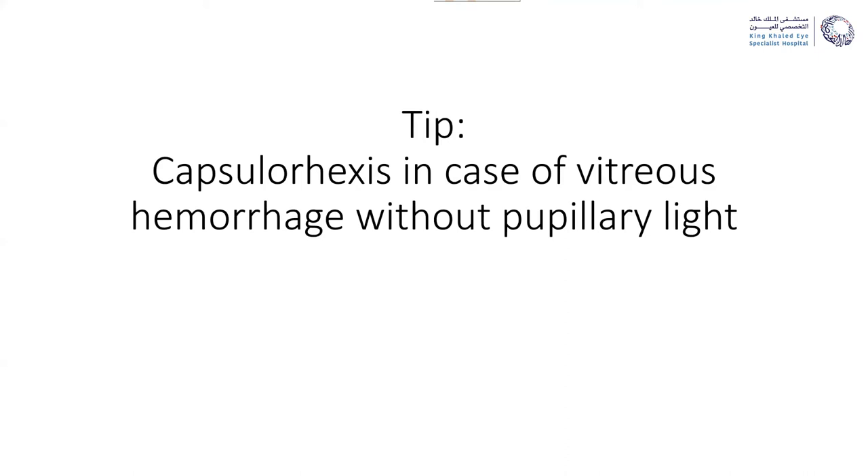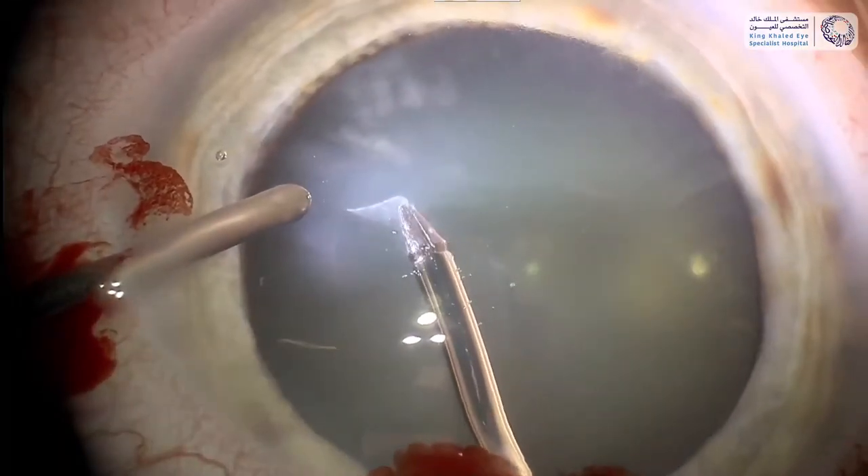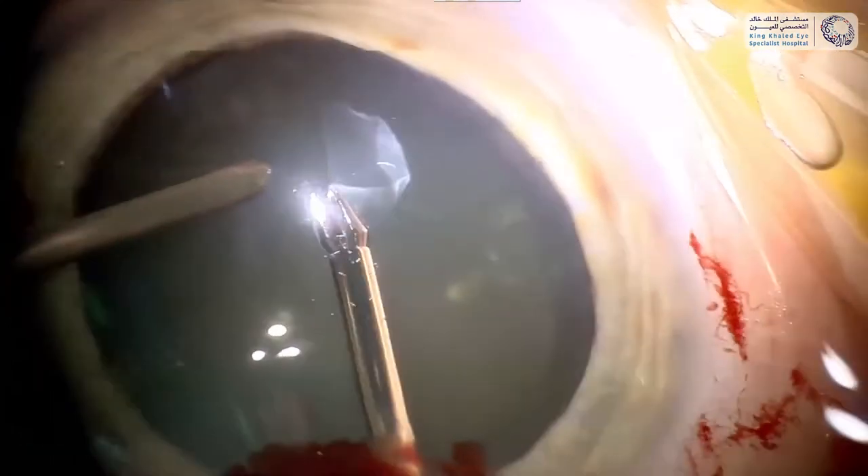As an intermezzo I wanted to show a very short video with a practical tip. When you do trauma surgery you often have eyes completely filled with vitreous hemorrhage so you have no pupillary light. If you have to do lens surgery and perform a capsulorrhexis, since you will do vitrectomy after the cataract surgery you'll already have your light fiber on the table — just insert the light fiber from the side opening. You can see the rhexis very nicely by shining from the side on the capsule, and with your rhexis forceps grasp the anterior capsule and make the capsulorrhexis. You can do it without any pupillary light.